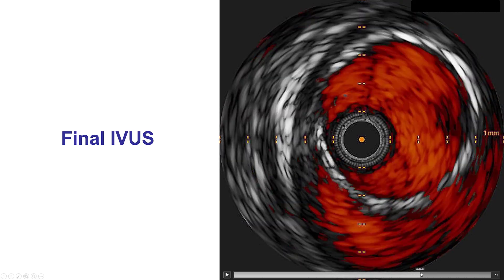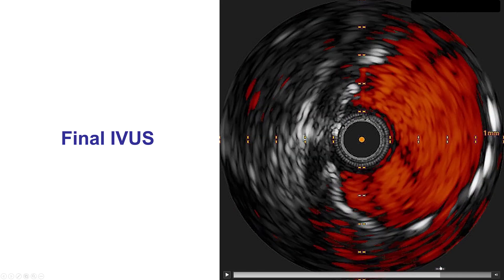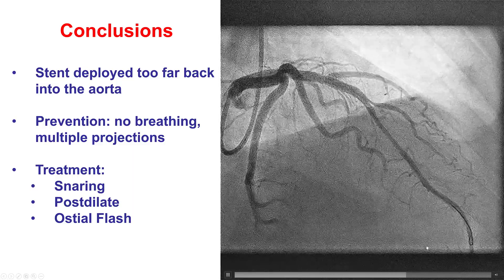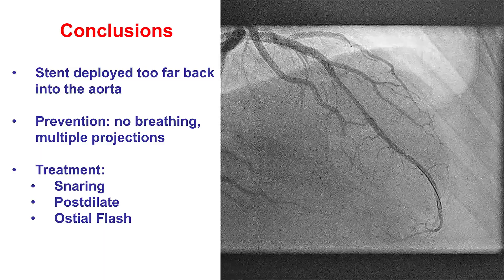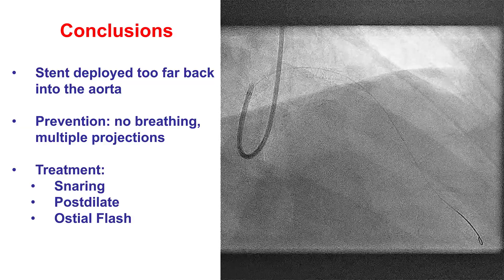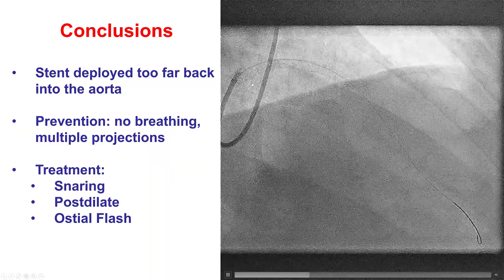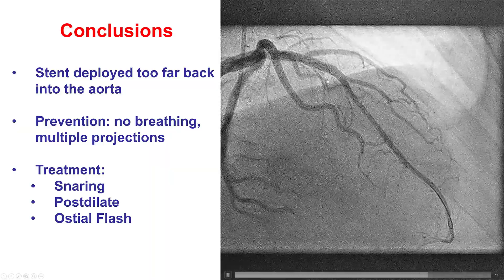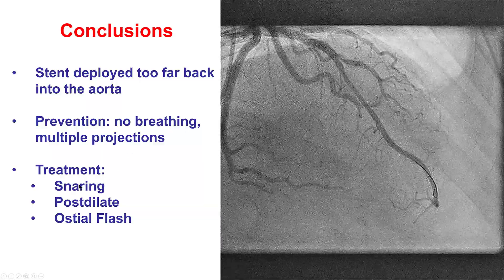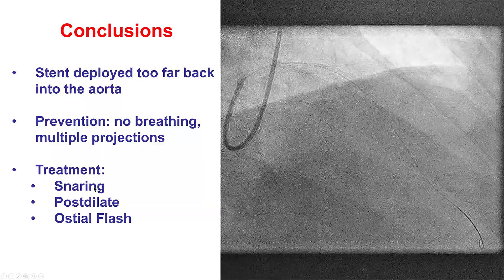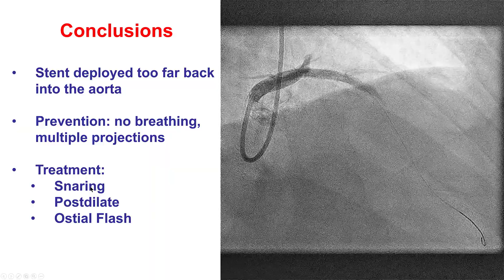The stent is actually protruding all the way into the aorta. In summary, this is a case in which there was movement of the stent during deployment that led to geographic miss — missing the lesion — and led to stenting the left main, which did not have any significant disease. What could have been done is to take the stent out by snaring it, but this potentially could carry the risk of injuring the vessel.